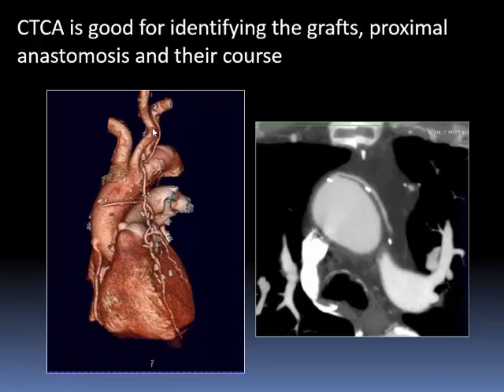I think one of the things about CT angiography is, as doses are coming down and as people are getting more and more confident, what you'll find is, I suspect in maybe 5-10 years' time, people will have a CT angiogram as a roadmap before angiography. So in other words, so that the interventionalist can plan procedures, can work out who's going to need PCI, who's not going to need PCI, who's going to need FFR, who's not going to need FFR.